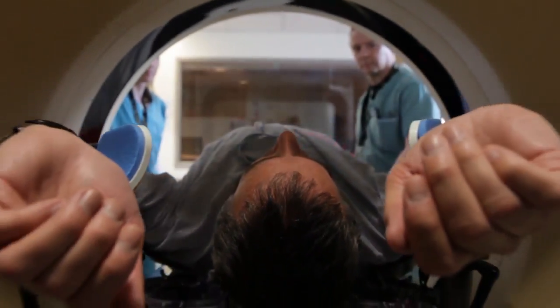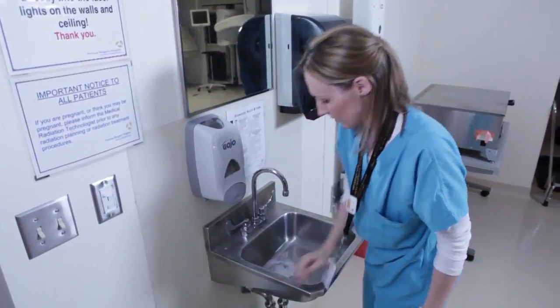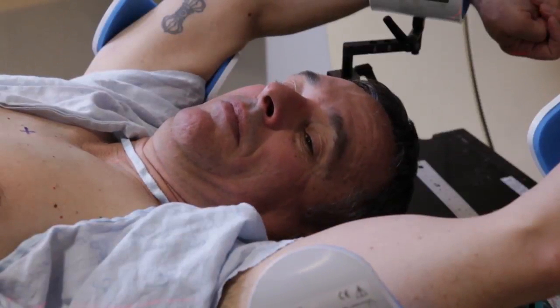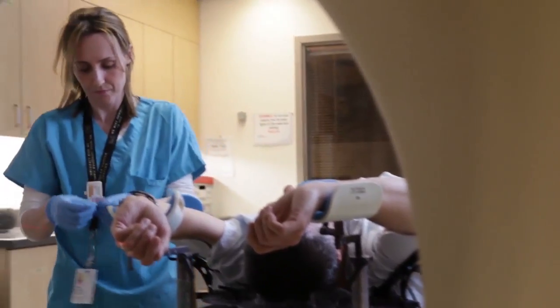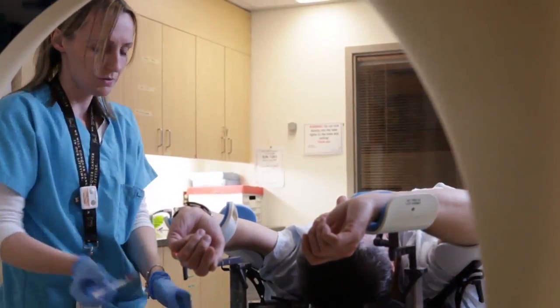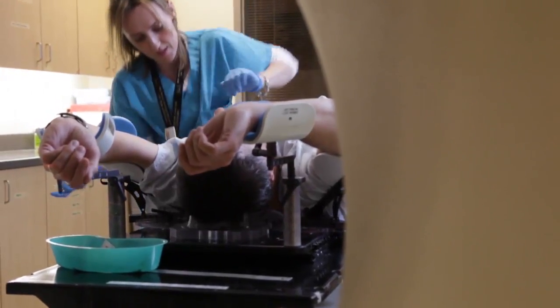Depending on the area being treated, you may have to receive positioning tattoos that are applied using a very small needle. These tattoos are used as a guide for the radiation therapists so we can line up the radiation beam to the exact area we want to treat every single time. The tattoos are used to ensure proper position but do not necessarily represent where the radiation will be directed. These tattoos are permanent, but the other larger marks made with a marker during the CT simulation process will wash off. The application of the tattoos I did not find particularly painful — it's similar to having a ballpoint pen pressed against your skin very lightly, a very small scratch just underneath the first few layers of skin, and it feels like a very small mosquito bite.